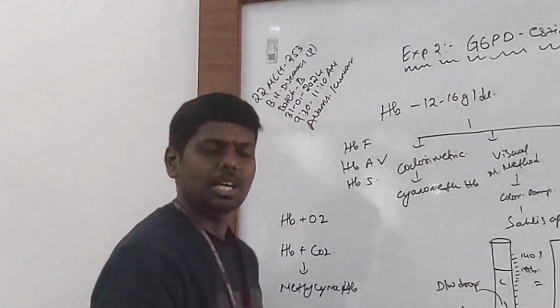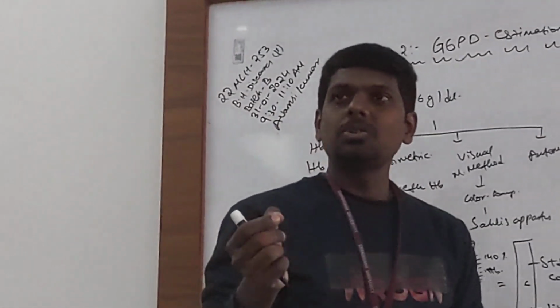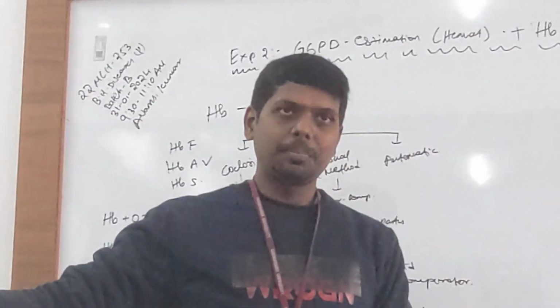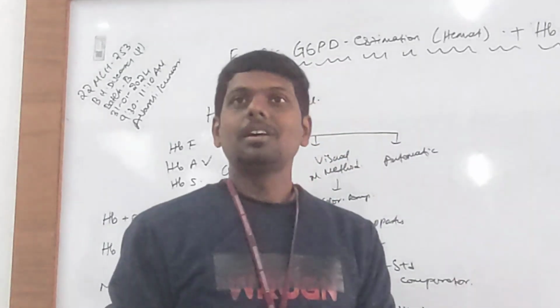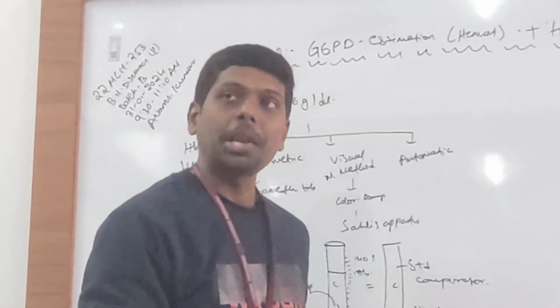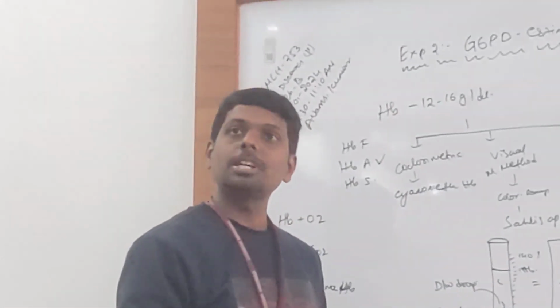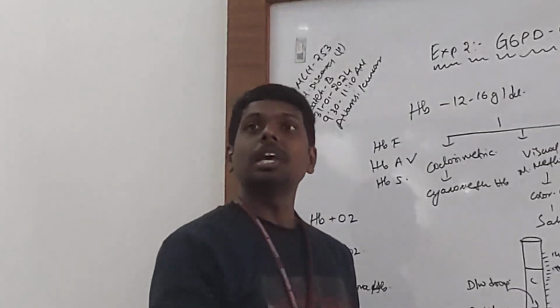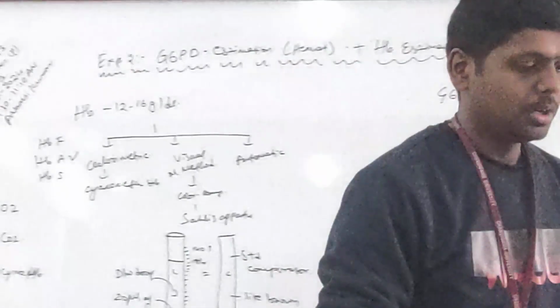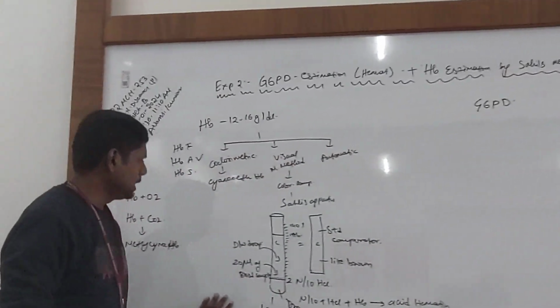That's the idea. At the end of the day, we are trying to reach the most interior healthcare facility. When you think of villages, there won't be any trained staff, and we cannot give complex tests to them. So we are trying our level best to keep the test as simple as we can, so they can do the test in their lab, and the people will get the benefits of quality healthcare. This is all about Sahli's.